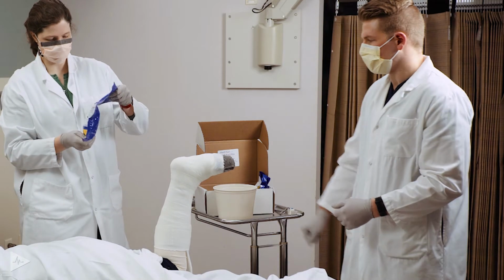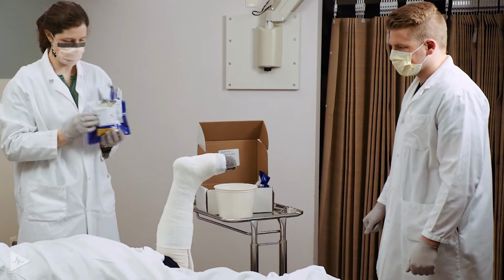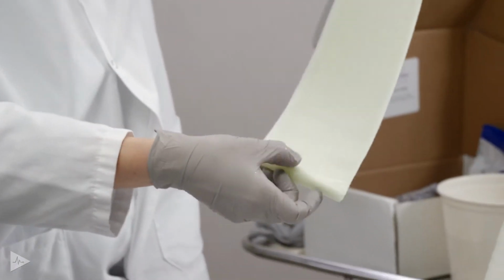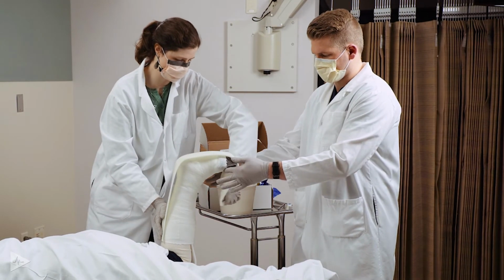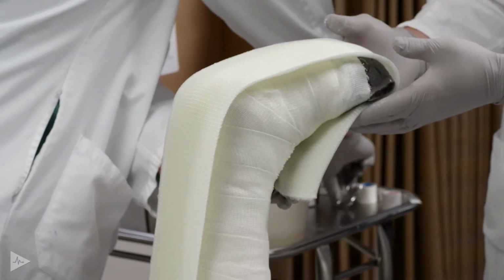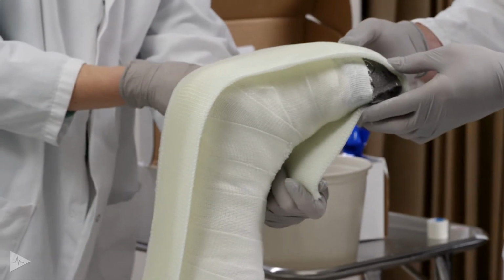The next layer we will apply is the first fiberglass pre-cut splint. And so this will roll out into one long fiberglass sheet here. You'll place the bottom at the proximal end of the cast, go over the heel, and then wrap over the toe. So for this patient, we have excess through this region, so we will trim that back. So that's landing on the forefoot.